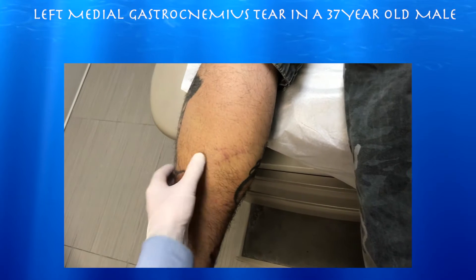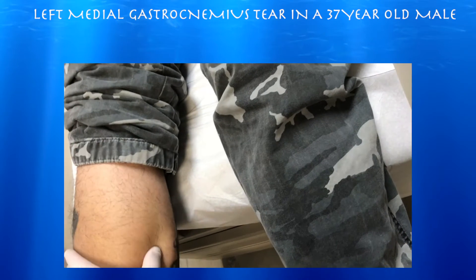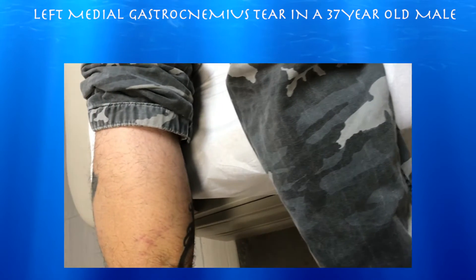Tenderness is localized here, and also over here, but not as much higher up — mostly in this area. There's a little ecchymosis there too. The most likely spot to tear is right there at the medial gastrocnemius.